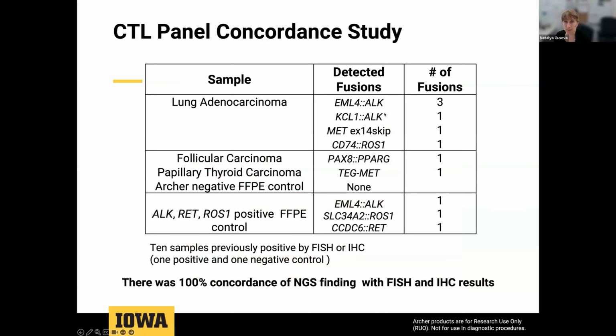So for initial evaluation, we had 8 samples which were previously positive either by FISH or IHC. And we also had negative and positive controls. The results were 100% in agreement with our previous positive findings.